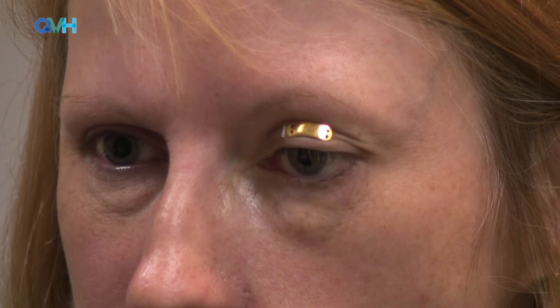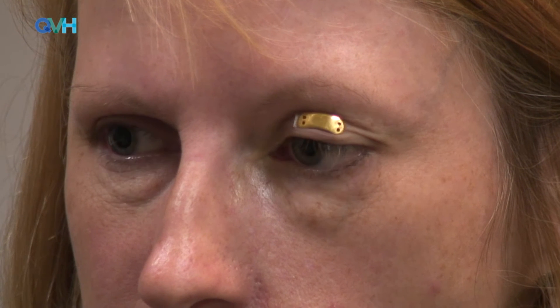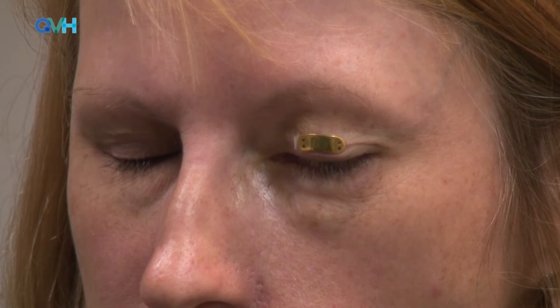The patient is then asked to open their eyes and is given time to report how this feels. This patient reports that a one gram external weight feels comfortable and not too heavy. With the patient looking straight ahead, the external weight should sit directly above the cornea and not to one side. The patient is asked to gently close their eyes and ideally the eyelid should close completely.